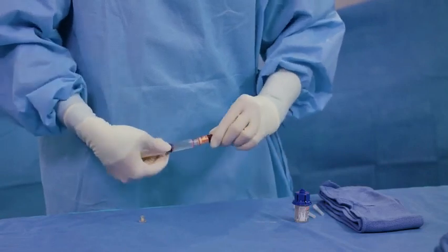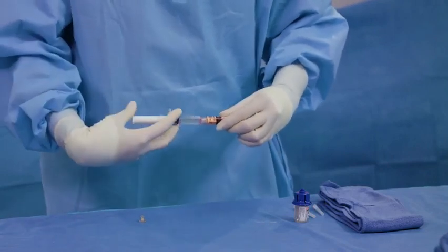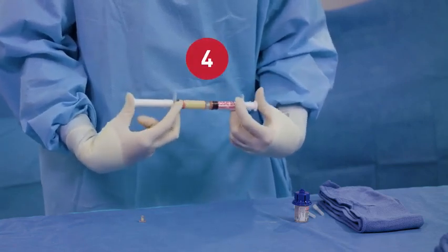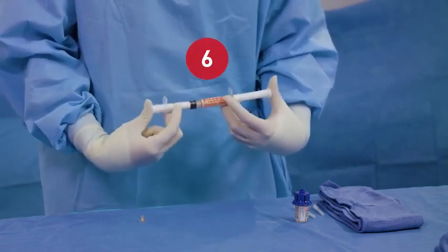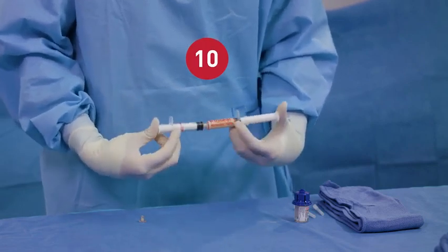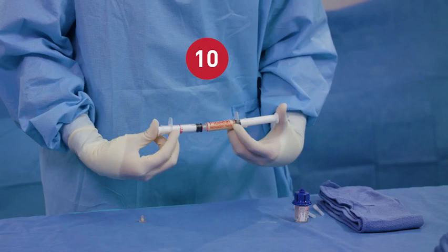Connect the thrombin syringe to the gelatin syringe. Quickly and firmly push the thrombin solution into the Flow Seal gelatin matrix. Transfer the mixture between syringes for a total of 10 back-and-forth passes. Push the Flow Seal matrix into the syringe labeled Flow Seal, and keep syringes connected until ready to use.